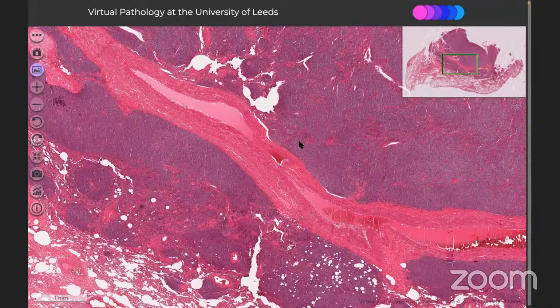So this is how you frame your script and answer this. And never forget to discuss this case in the hematolymphoid MDT and thoracic MDT, and ultimately this case will be referred to the HMDS.